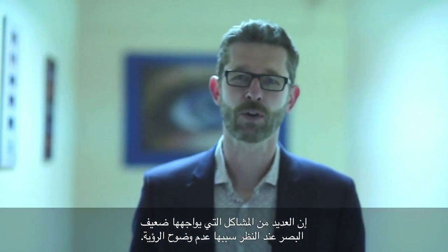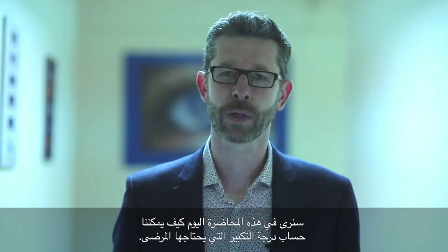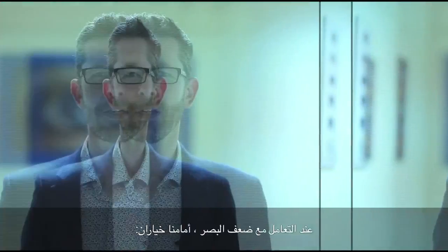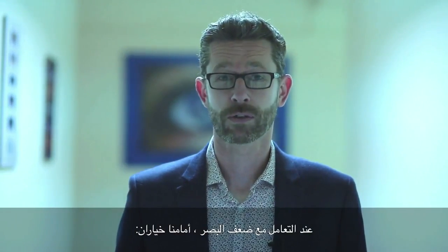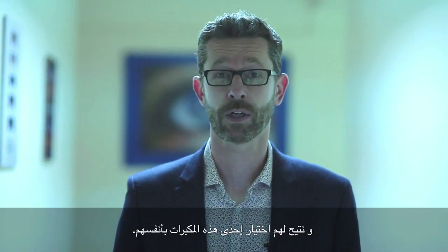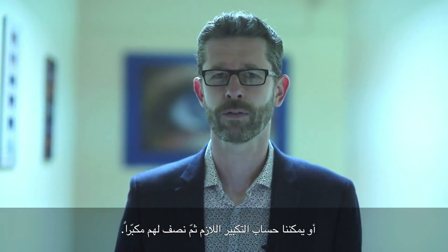Many of the problems we see with low vision come through lack of clarity or lack of resolution. With the video today, we're going to look at explaining how we can estimate the amount of magnification our patients may need. In low vision work, we have two choices. We can simply put a big box of magnifiers in front of our patients and allow them to choose the magnifier for themselves. Alternatively, we can start to calculate magnification need and prescribe a magnifier.